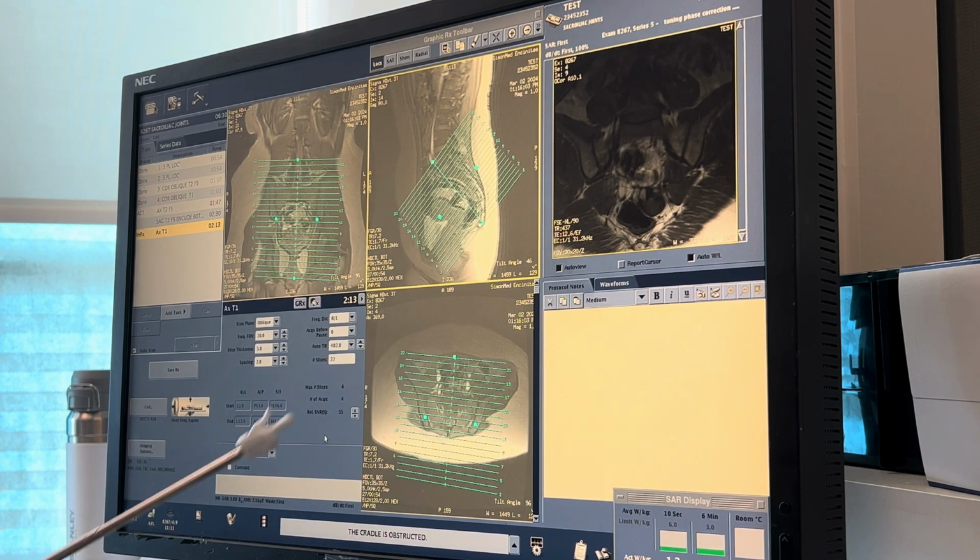Okay. 22, so we could try to go up to 11 again. Let's see. Let's click here and do 2 acquisitions. Oh, it doesn't give us that option. Okay, yeah, keep going. Let's see, it might be out of range.